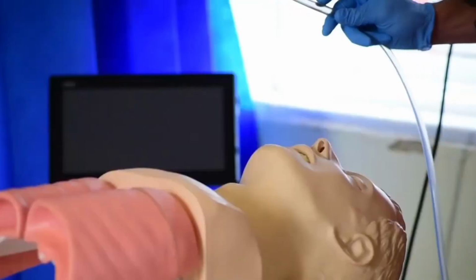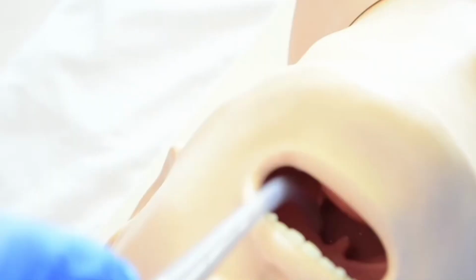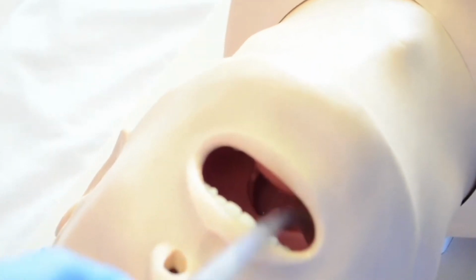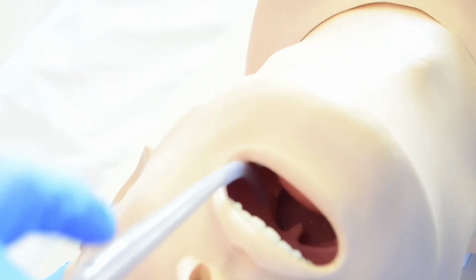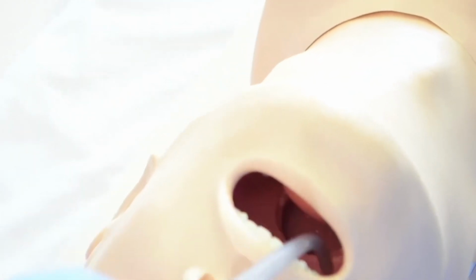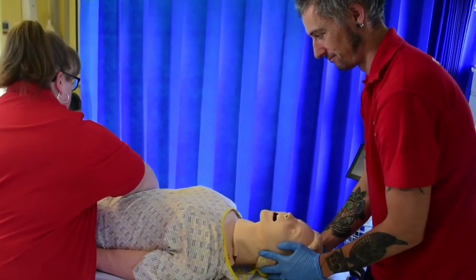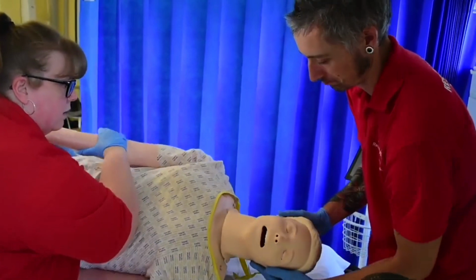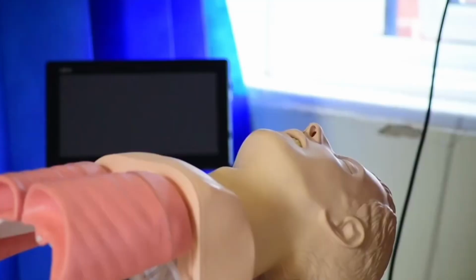The semi-rigid Yankauer suction catheter should be inserted into the open airway, keeping the tip in view at all times, avoiding trauma to the soft tissues of the airway, and avoiding stimulating the tonsil beds, which may provoke a gag reflex. Copious liquid in the airway, such as vomit, can be removed rapidly by tilting the patient to one side. You may need assistance to carry out this safely.